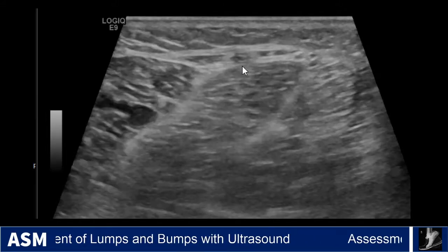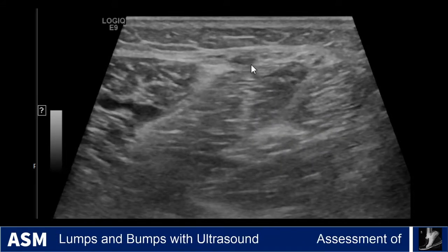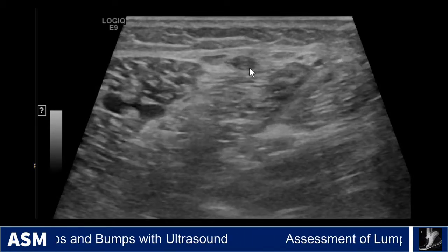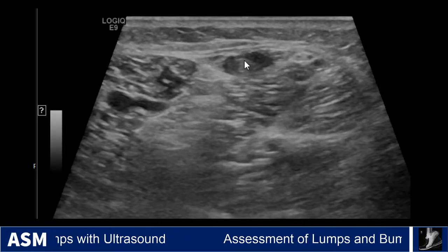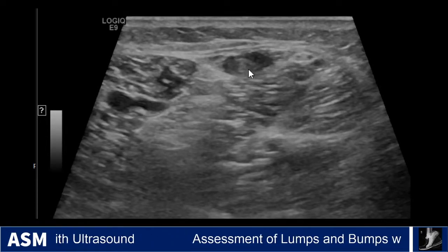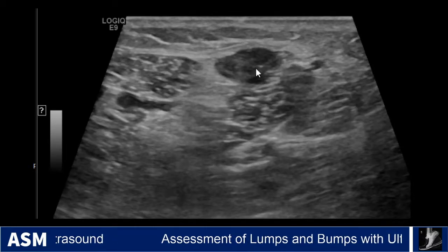And as we scroll proximally, you see the vein, which is what the structure is, beginning to dilate, and then it runs directly into this mass that's appearing. So you see it's within the mass, and then it just disappears in the mass.